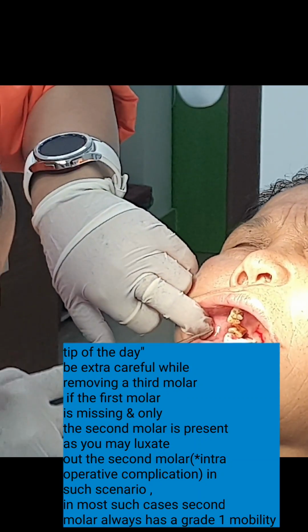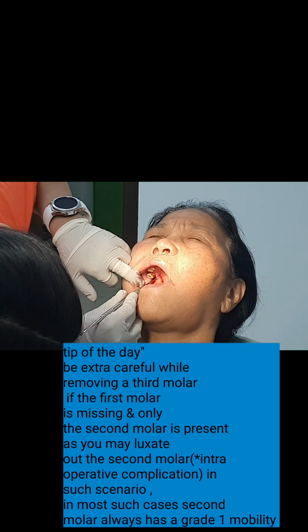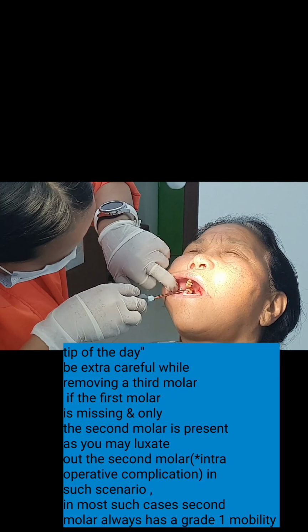Therefore, in such cases, I will always advise you to use forceps if you are not expert with the elevators. I have removed the third molar here with a luxator.